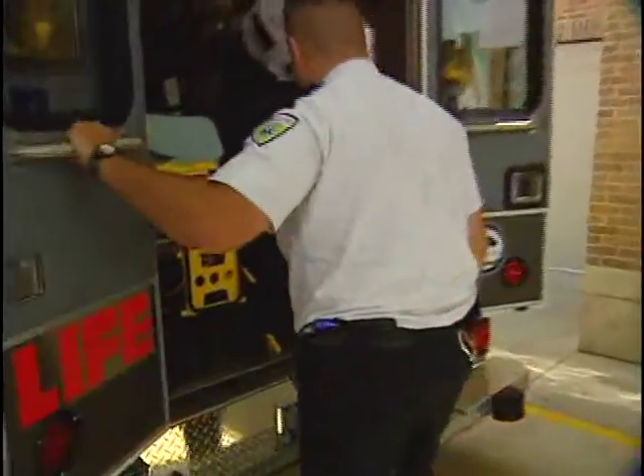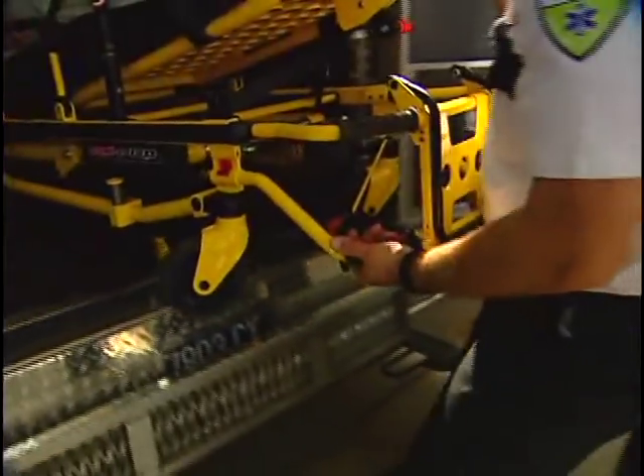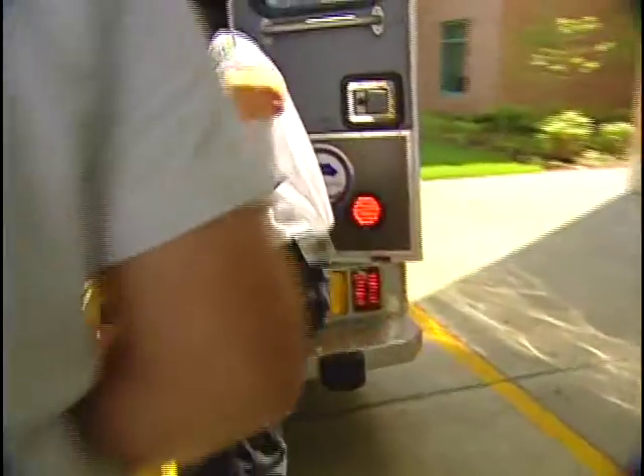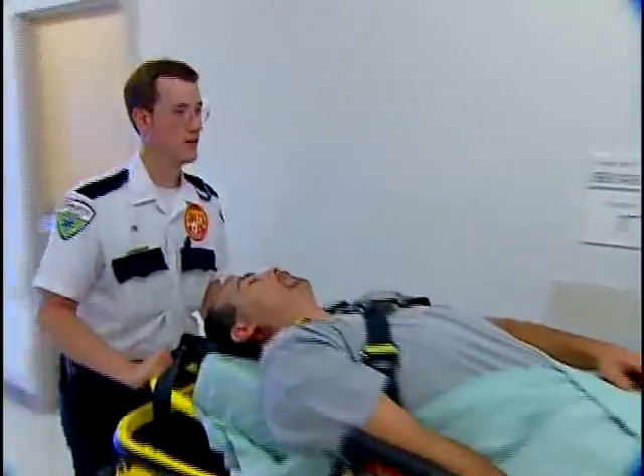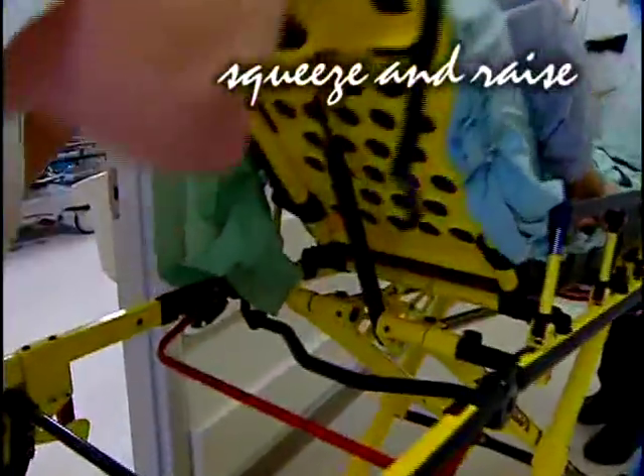I keep them raised, even though you can transport and load the cot without the side rails raised. If the safety restraints are secured, they're just good secondary restraints. You can actually shorten the length of the cot to 61 inches by raising the backrest, then squeezing the red release handle in the base frame and swinging it away.